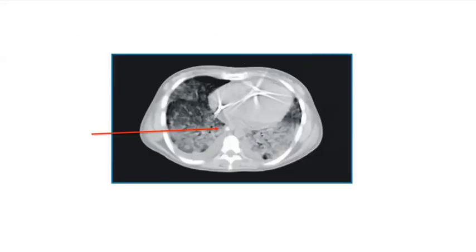So this is a CT scan, and you recognize the mediastinum, the lungs, the vertebrae, and this is the esophagus, right?